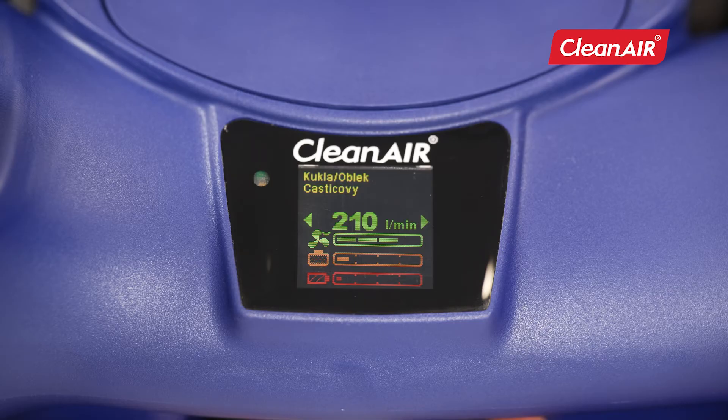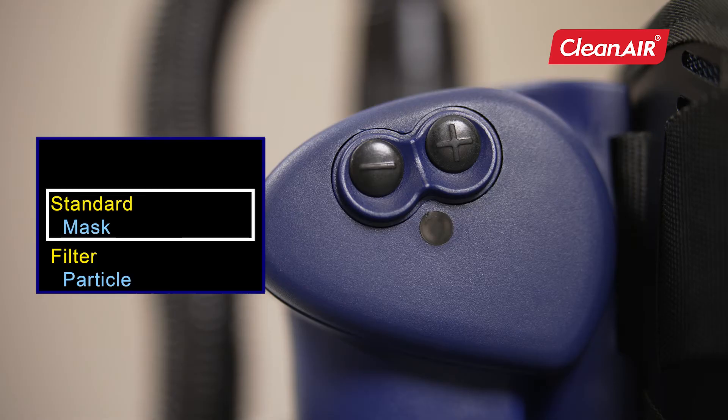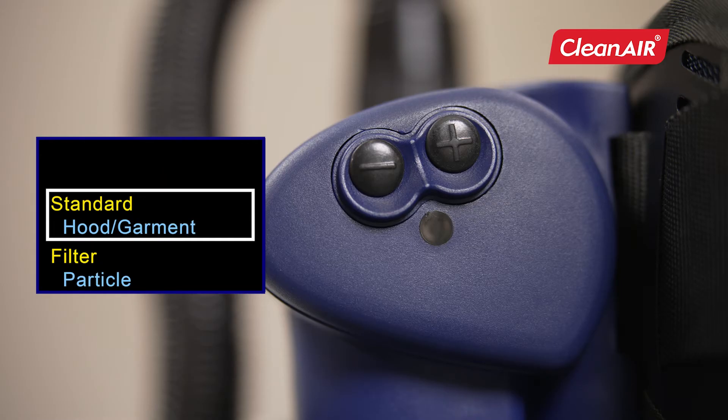To enter the menu, press the plus and minus buttons simultaneously for three seconds. Press the plus button to change the settings of the item. Press the minus button to jump to the next menu item. Hold down the minus button for two seconds to jump to the previous item.